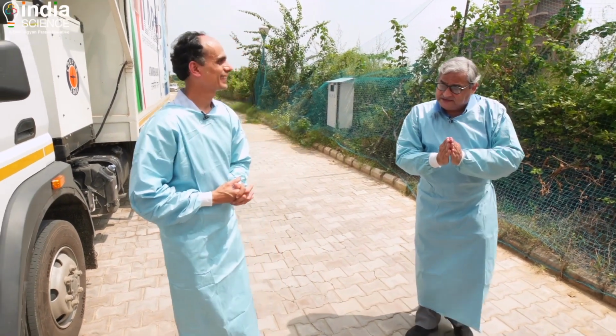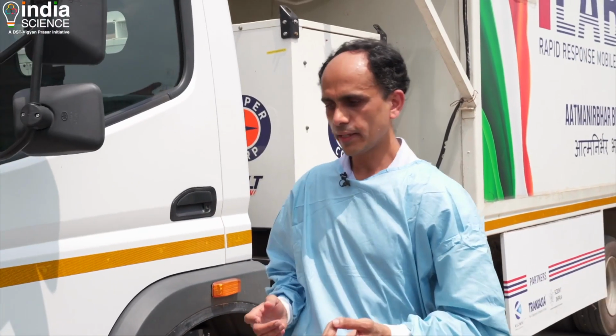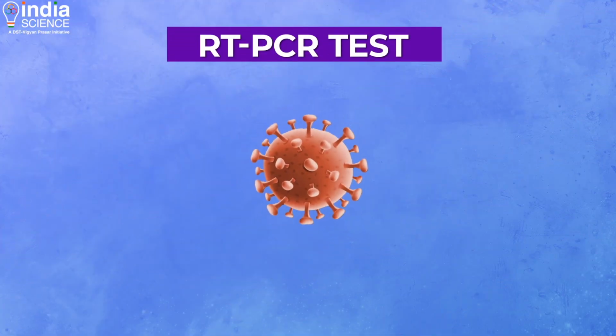But tell me a little bit. Now, you mentioned the tests. Now, very quickly, one after the other, can you start with RT-PCR and tell me about the tests? Yes. One by one. Yeah, as I said, there are nucleic acid based tests, antigen based tests and antibody based tests. So RT-PCR detects nucleic acid of the virus.